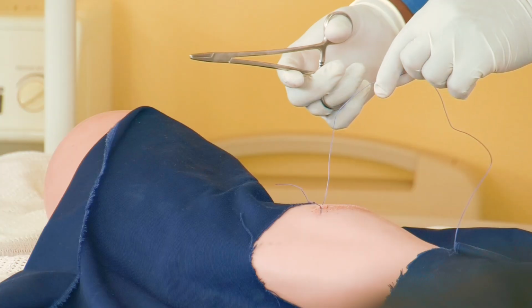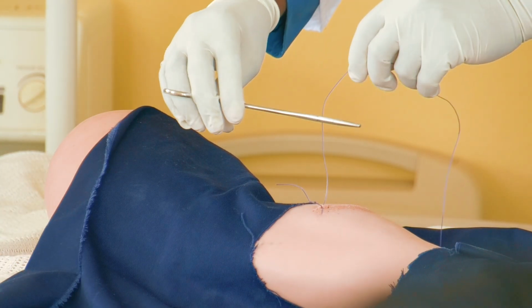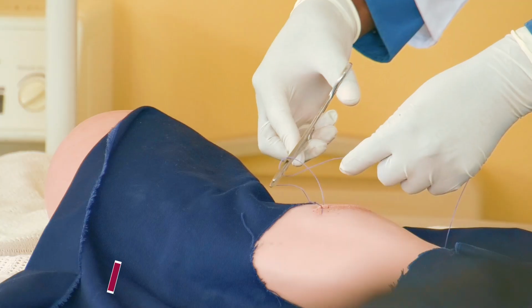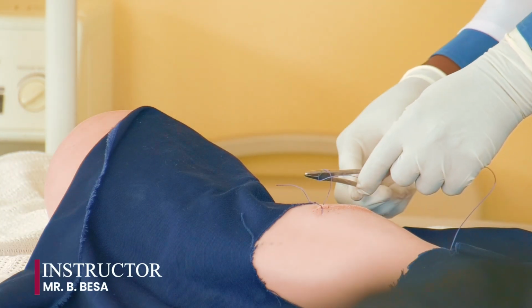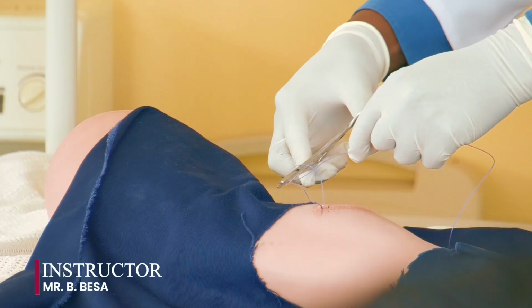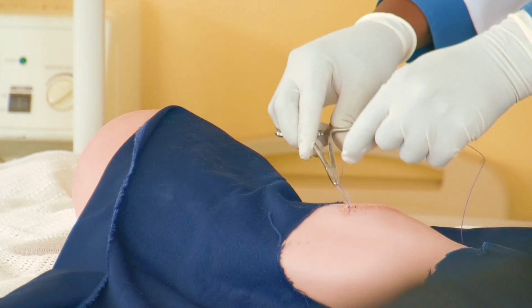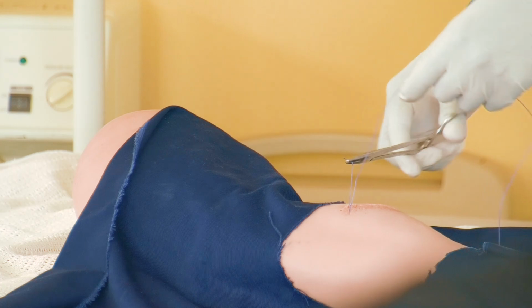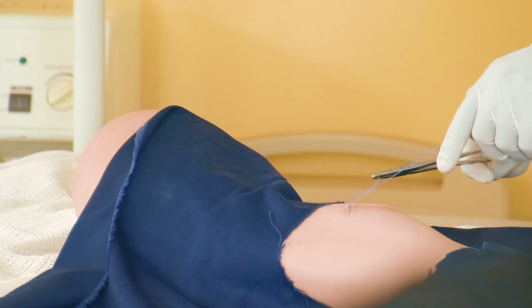So again, I'll just do now. Since this is twice, I will be going with one. Remember, the one that is this side will come here, then this one will go this side. That's a knot that will hold. Okay? Pick, then the knot here. Just twice, this is enough. Okay, I was supposed to have just a receiver here.